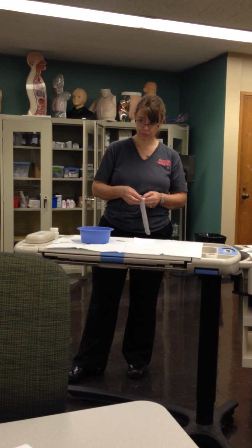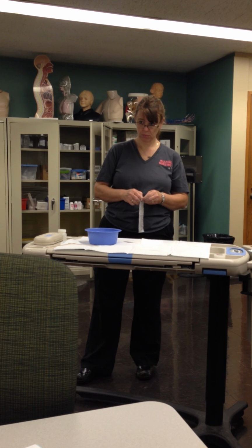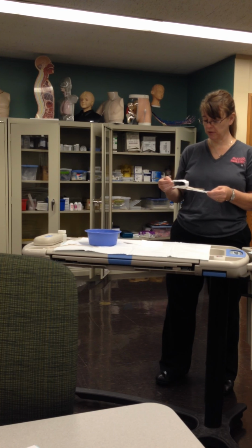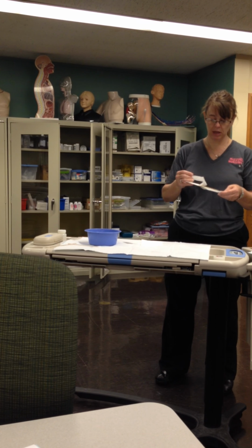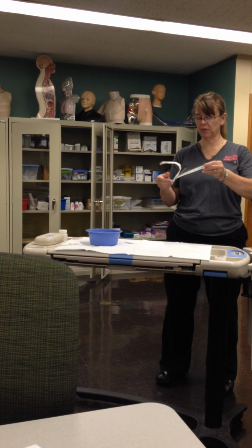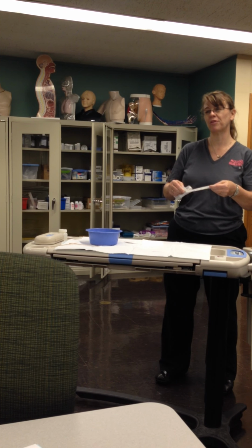Can you do it where you walk over to the other side, so then you weren't really reaching over? Like if you do it from this other side where your gauze and stuff is laying down. This is how I was taught to do them. And Leah doesn't. Leah does them a different way, which works for Leah, but doesn't always work for me. And sometimes the Q-tips get caught in the sealant down here, which is always fun.